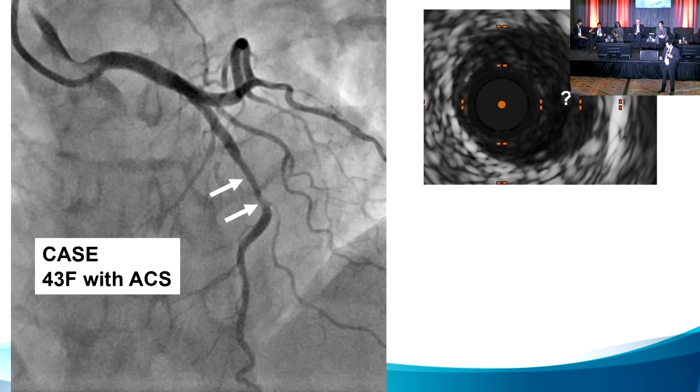What do you think? Well, if Dr. Gulati is presenting a case of SCAD, I'm going to say SCAD, but it looks like a hazy, classic ACS. Now, I don't know the history, but 43-year-old female, this could be type 2 SCAD. I'm so glad you didn't know for sure what it was. Kechi? Yeah, I agree as well. A couple of things make me think so: the other vessels have a little bit of tortuosity, and there's no real atherosclerosis in some of the other vessels. So SCAD would be on my differential.